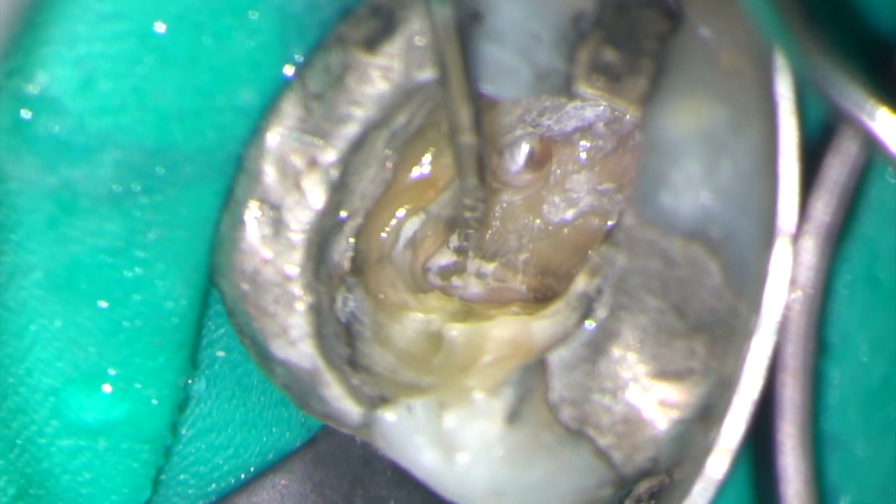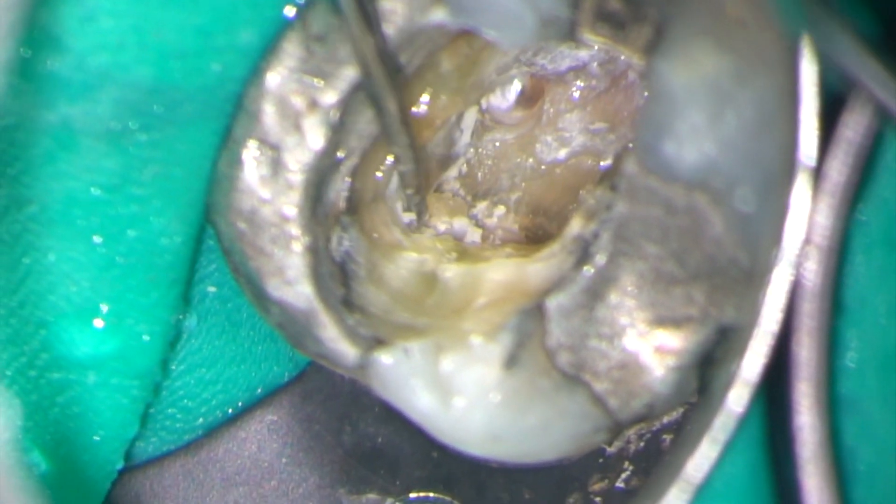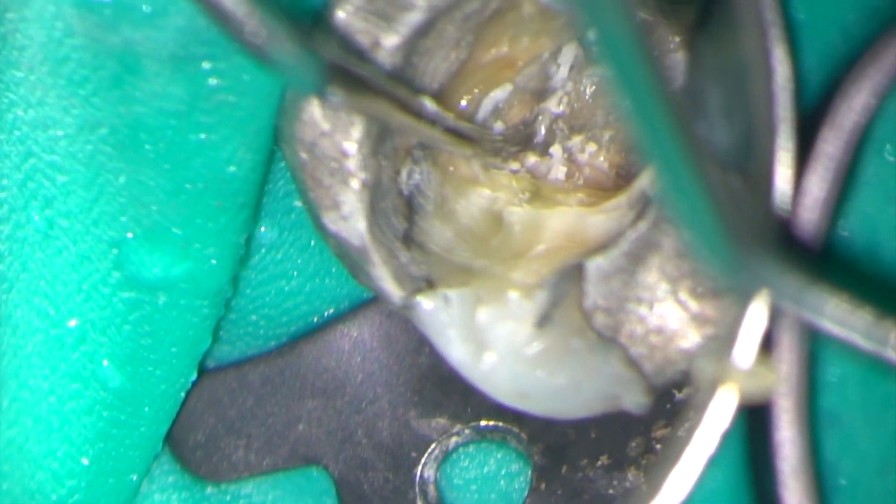There's some calcified material over the orifices of the buccal canals and I'm exploring this using a DG16 endoprobe. Next up is a StarTex 3 ultrasonic tip. I'm using this to refine the access cavity and remove any more calcified material from the pulp floor.